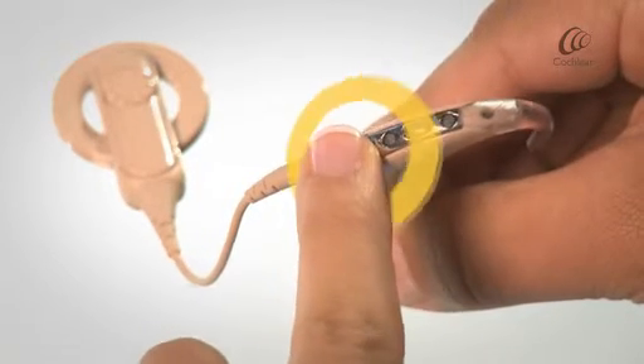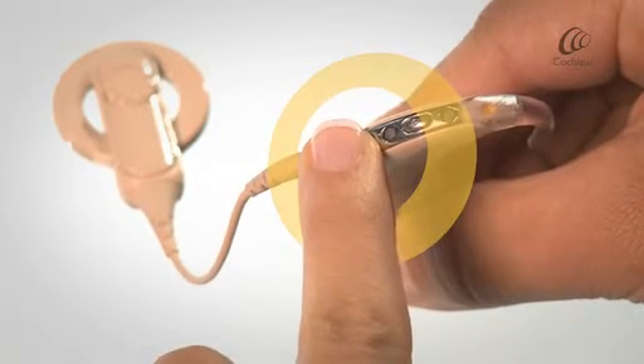To switch off the processor, press and hold the lower button.